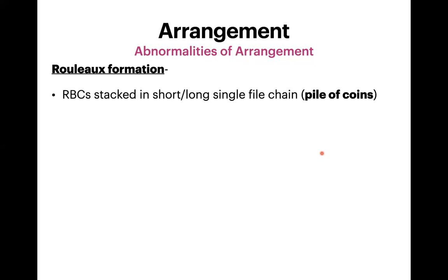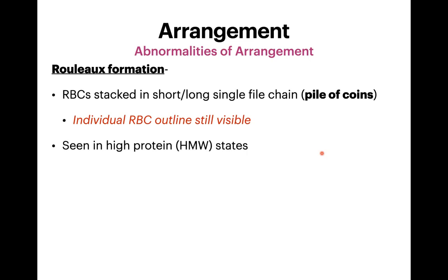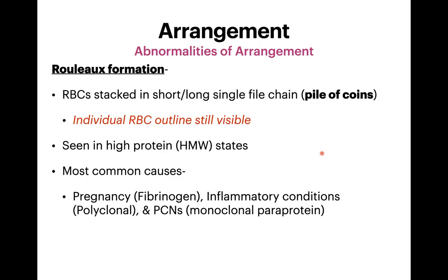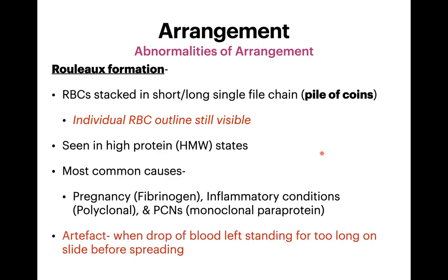The first is rouleaux formation, where RBCs take short and long single-file chain arrangements like a pile of coins. Importantly, individual RBC outlines are still visible in rouleaux — this differentiates it from agglutination. Some degree of rouleaux is normally seen at the head end of the PBF, but not in the body and tail. It is seen in high molecular weight protein states: pregnancy (elevated fibrinogen), inflammatory conditions (polyclonal immunoglobulins), and plasma cell neoplasia (monoclonal paraprotein). It can also appear as an artifact when blood is left standing too long before the smear is made.